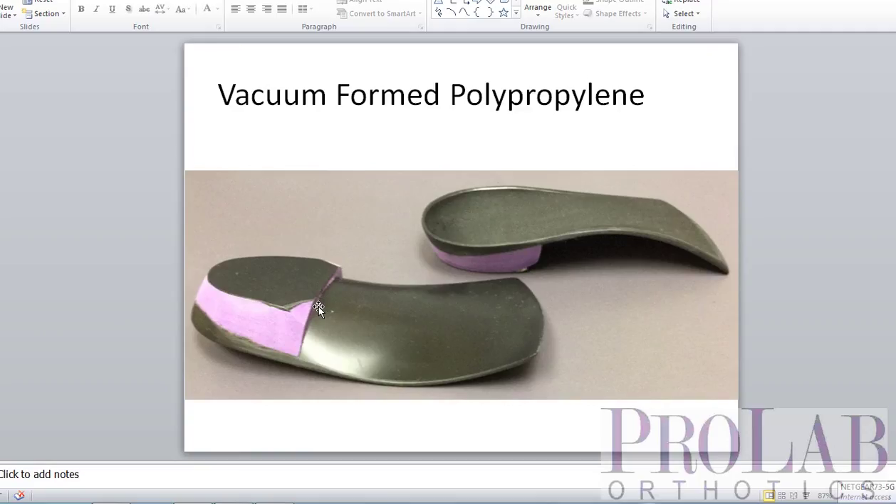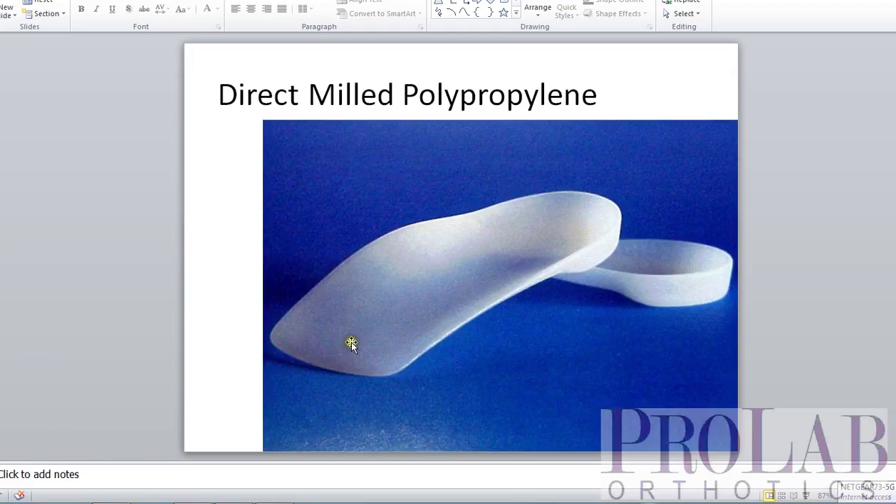The other option is that we can mill out the orthosis directly from a block of polypropylene. In this situation, we end up with a device of the exact same shape — it's just milled out directly. Now, there are just a few differences or some limitations on these milled devices.